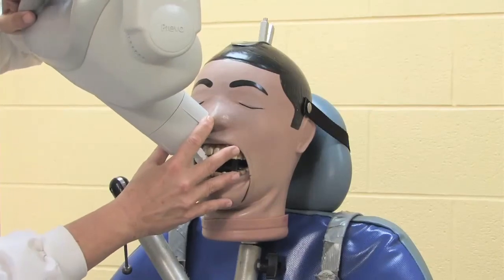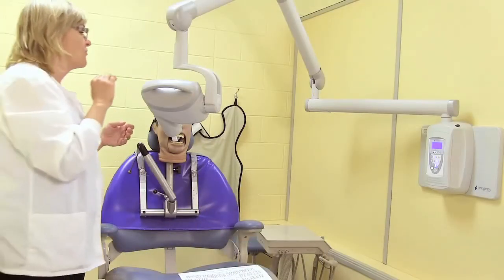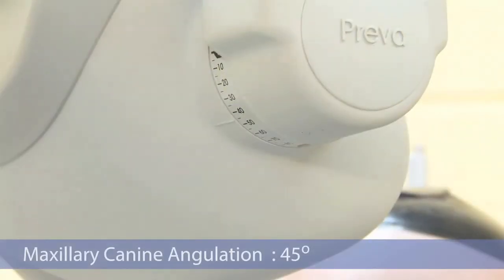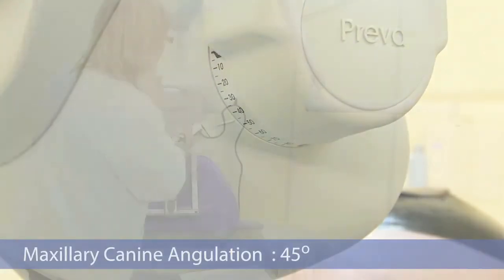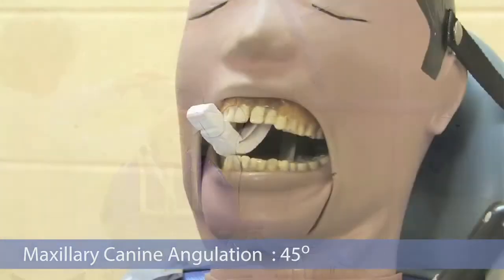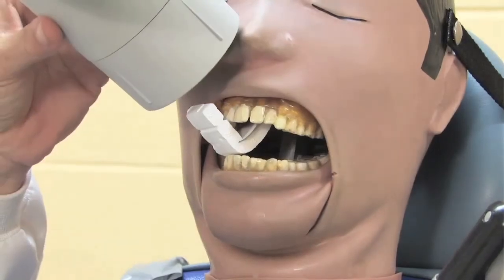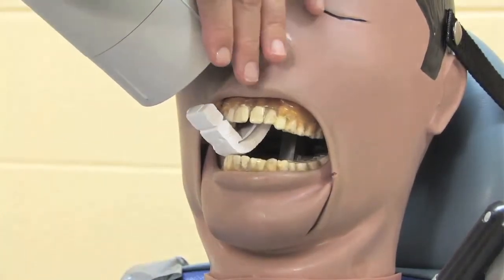Now my angulation in this case for the maxillary canine shot is 45 degrees. I'm looking at the film. Remember, the palate is shallow. The film is more flattened when placed. I look at my angulation indicator on the tube head arm, and it's now closer to 50 degrees to compensate for the shallow palate and the flattening of the film.